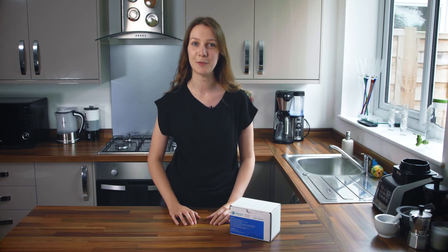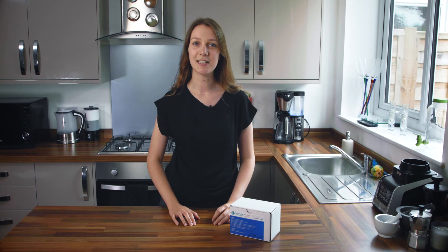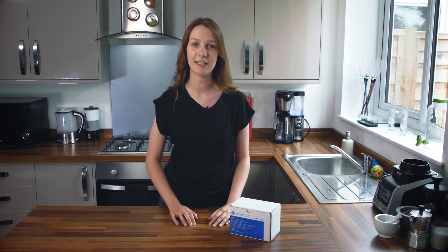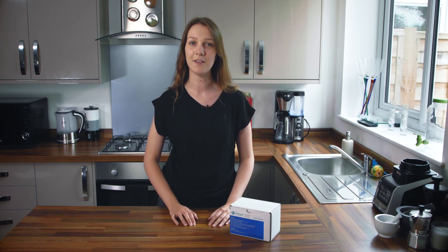Hi, I'm here to talk you through the preparation and performance of a postal breath test kit. This kit is for the detection of small intestinal bacterial overgrowth or SIBO. This test measures the levels of hydrogen and methane in your breath, gases which are produced by intestinal bacteria. By measuring these gases over different time points it gives us a really good indication of whereabouts in your gastrointestinal system these bacteria are and if there is an overgrowth.